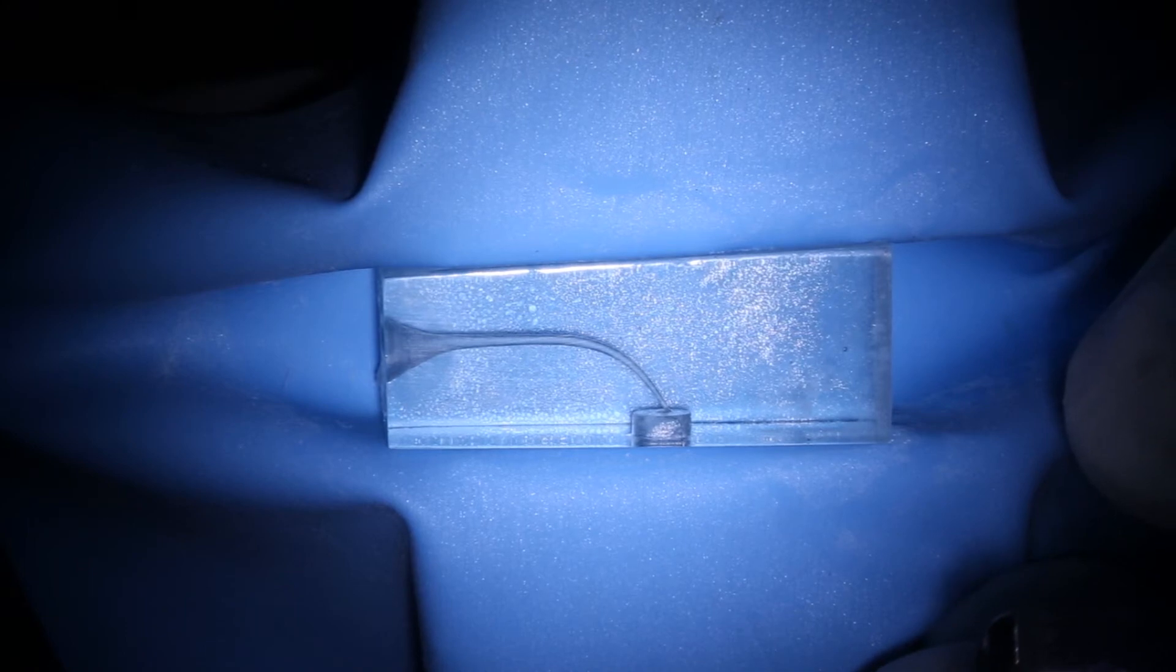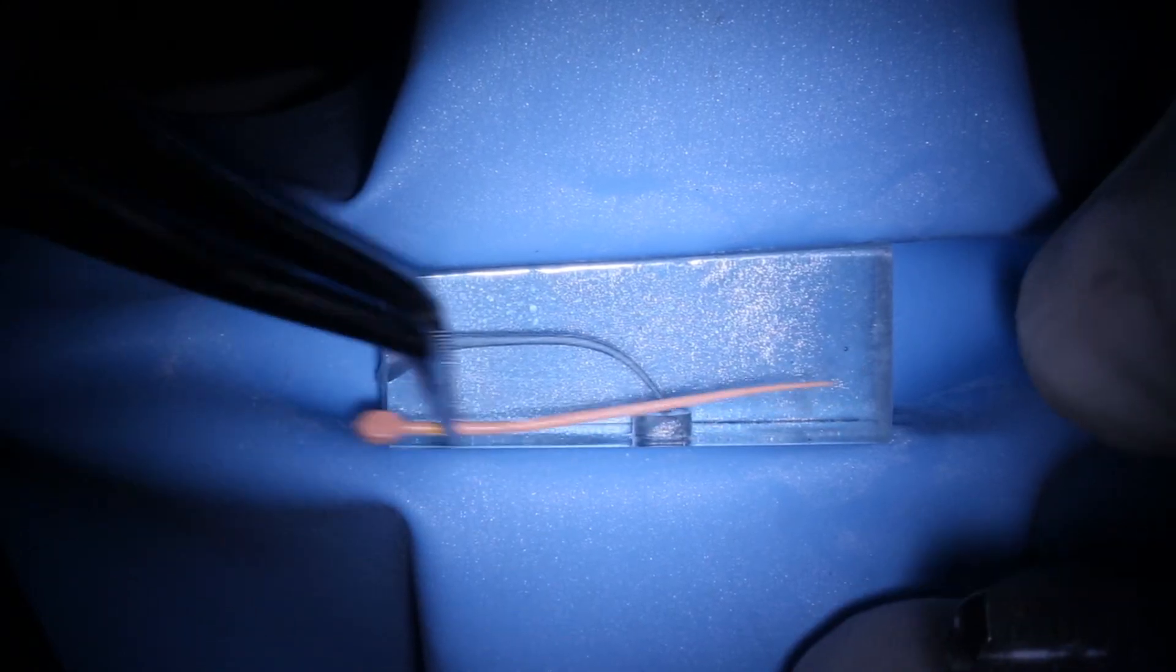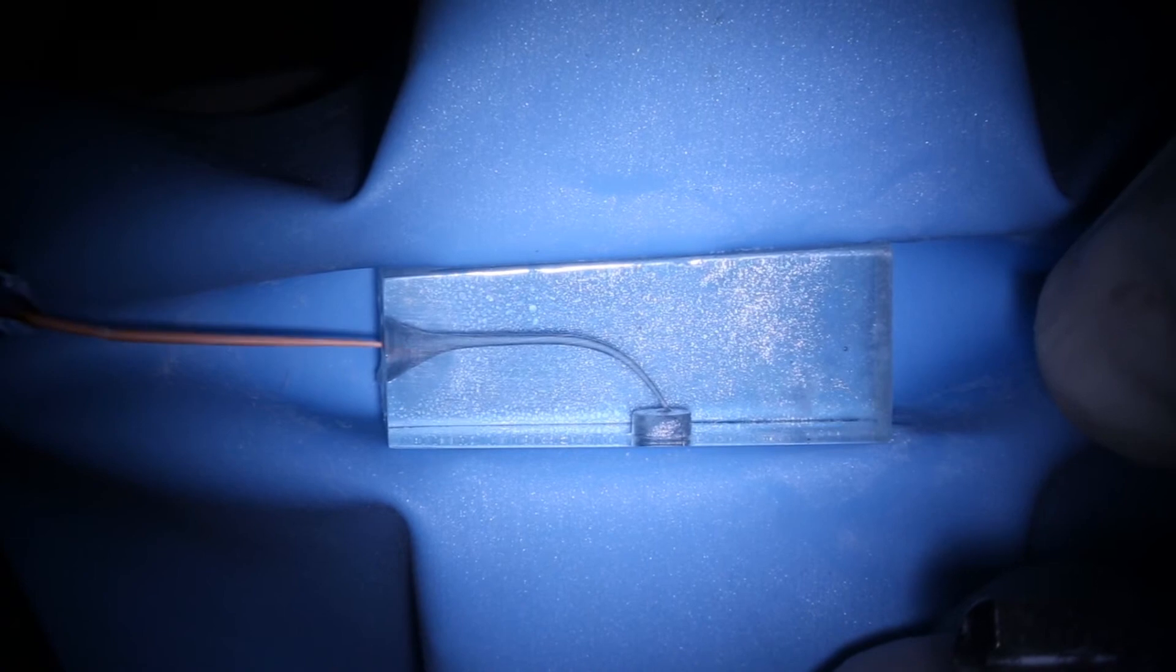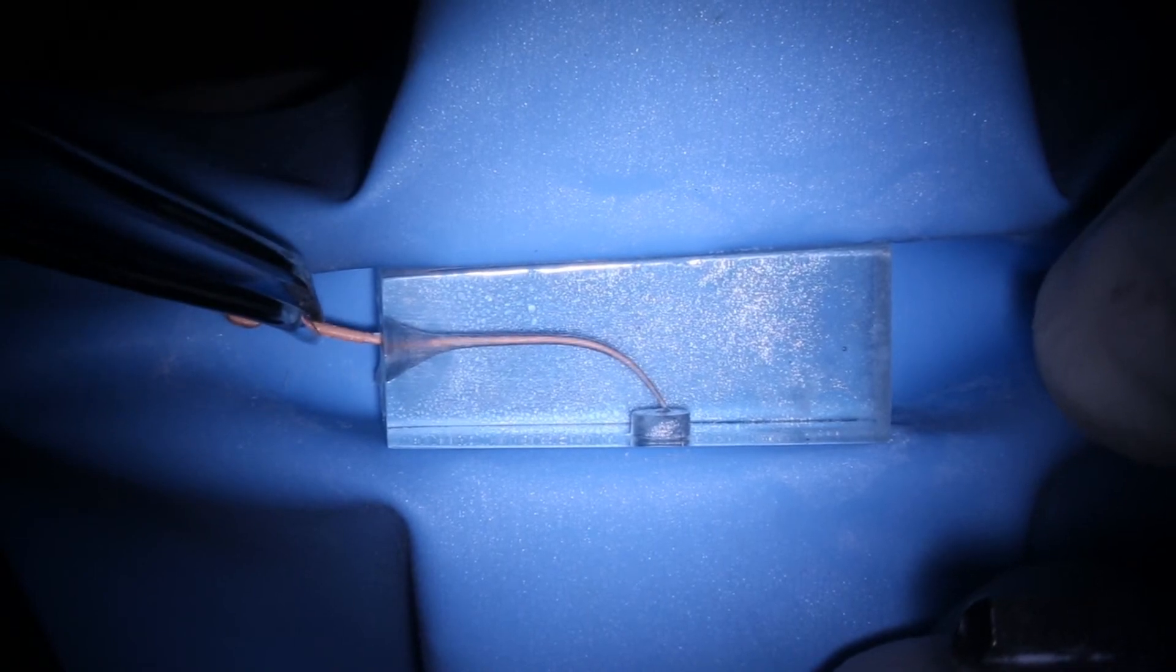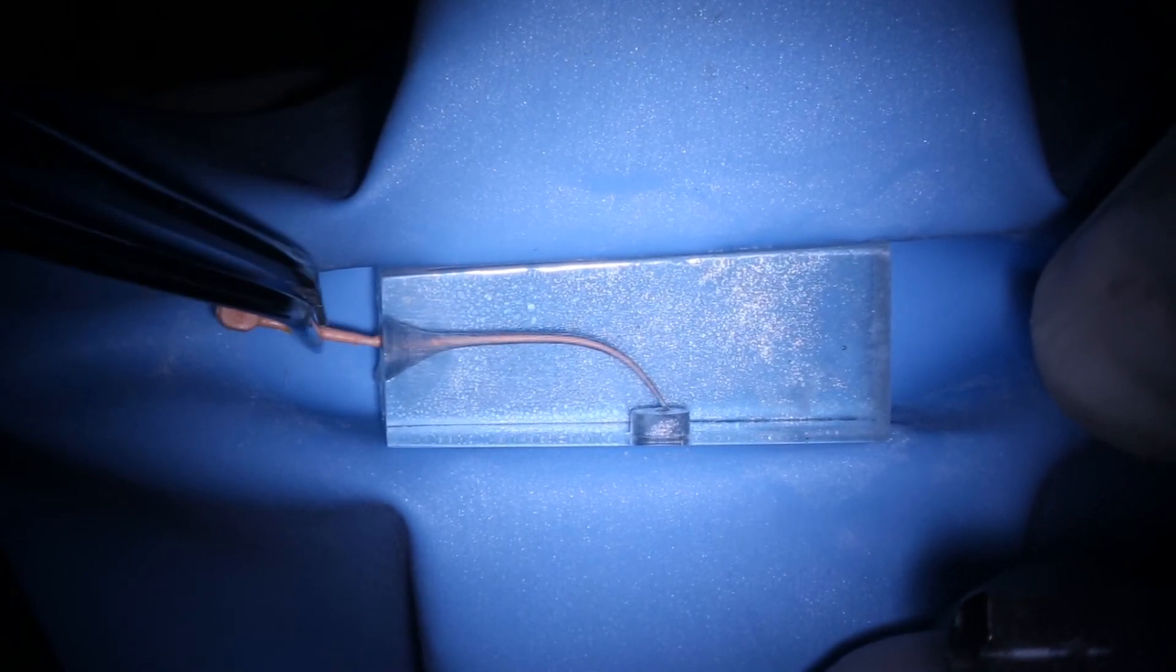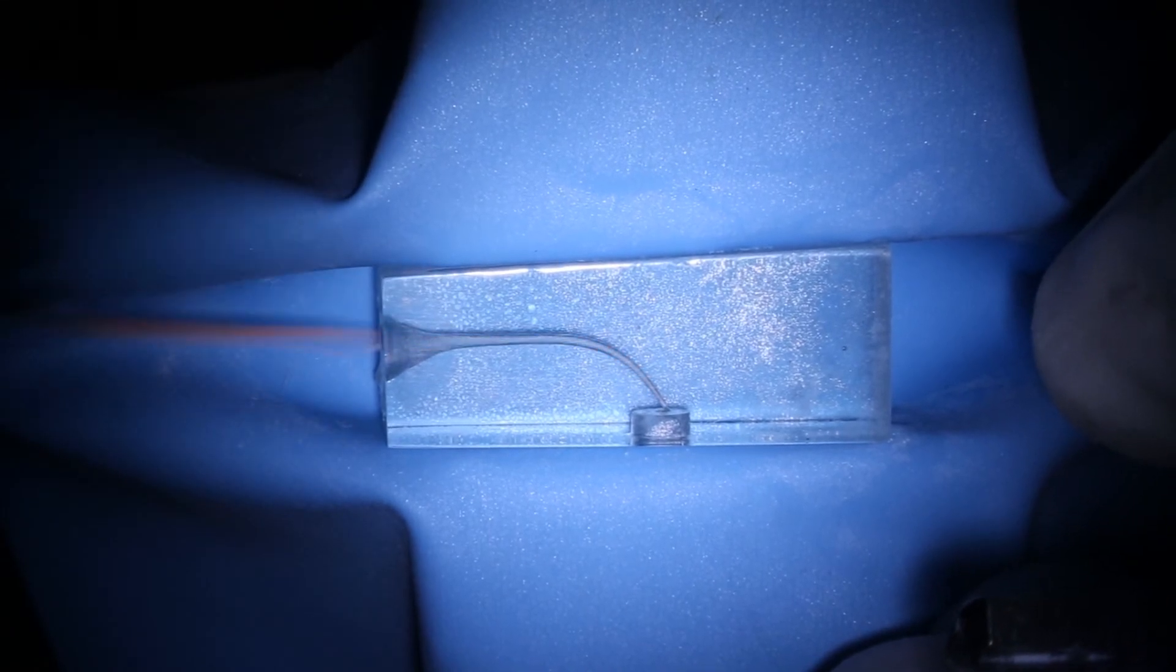Or we can use this true anatomy cone, which as we saw before, similar profile. And again, same thing. We'll seat to that cone. There's no change to that prep.